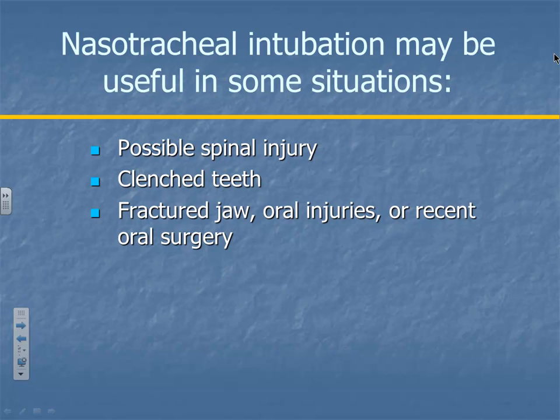If you've got some serious facial injuries, you know, if the jaw's broken, oral injuries and stuff, it may make it difficult for you to use a laryngoscope and intubate. So you may consider a nasal intubation, but they got to be breathing, right? Yeah. So this will never be done on dead people.